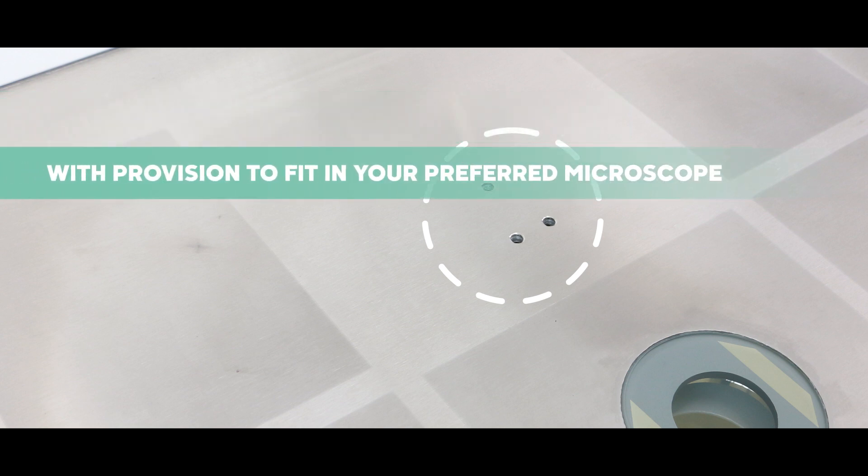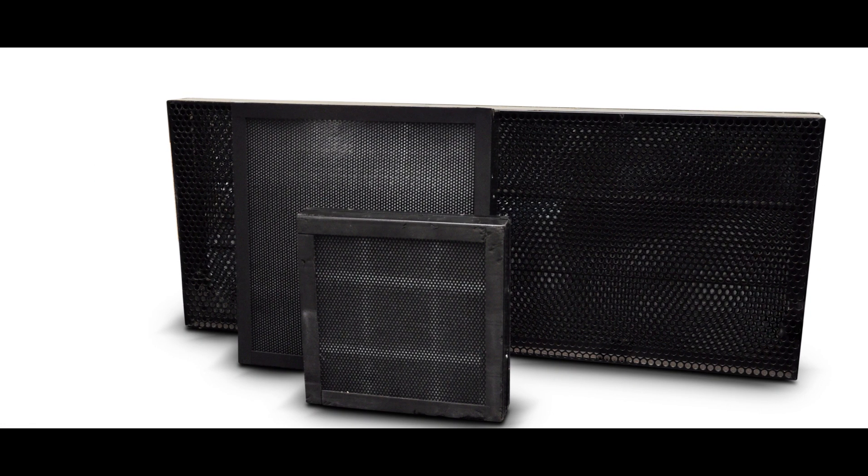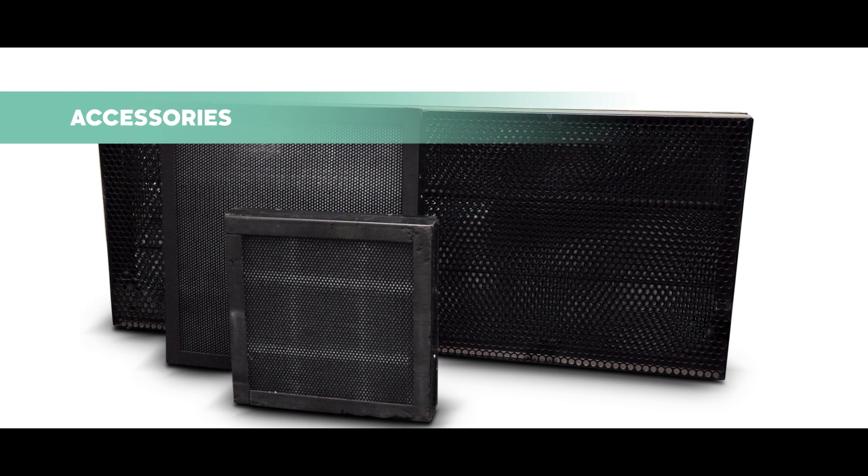Freedom and flexibility is also yours. We can provide you a provision to fit in your preferred microscope.